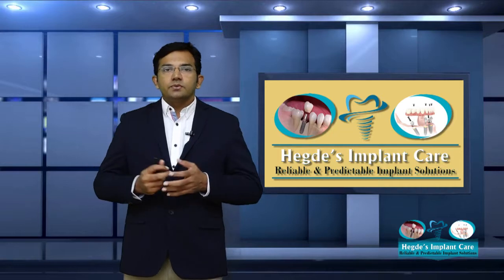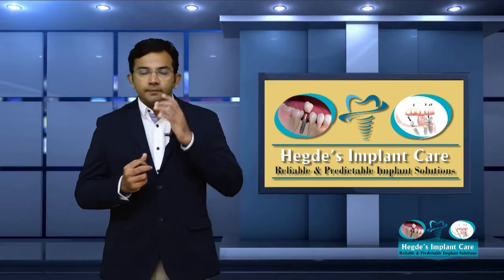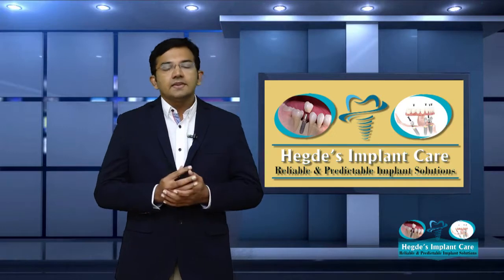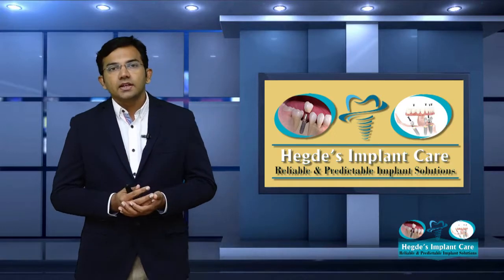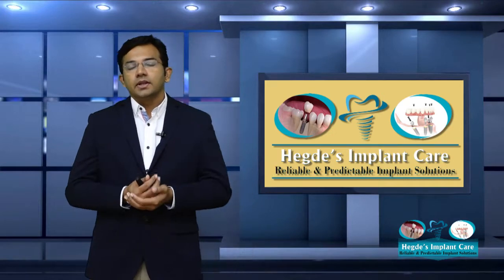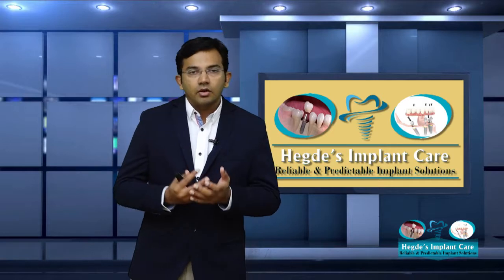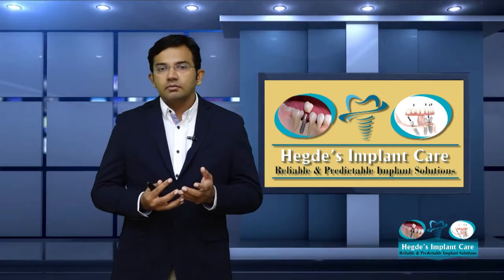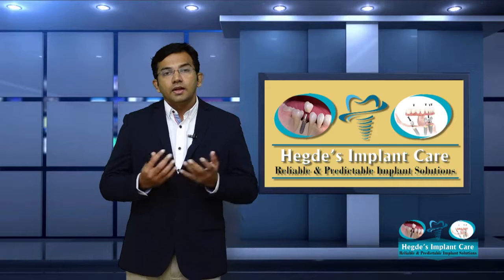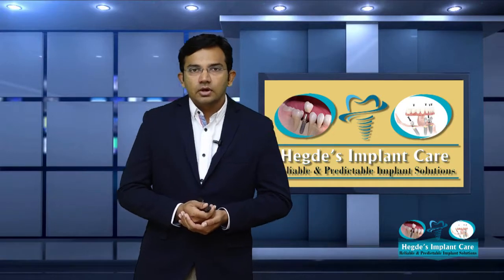Generally, to place implants, we need a good foundation of bone. When I say a good foundation, we generally place at least a 4 into 10 mm implant, which means 4 mm wide and 10 mm long. So I need more bone than that, at least 5 mm of width and maybe 11 or 12 mm of height would be ideal. Suppose we don't have so much bone, how do we go about it?